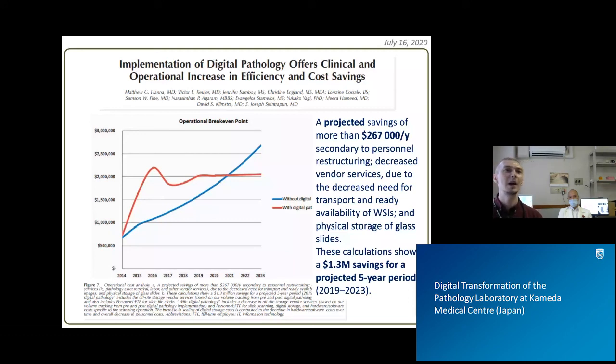And how much? Well, actually, I cannot answer in a simple way, yen-wise or dollar-wise. It depends, but for us, it's roughly $1 million for covering the 3 institutes. And you need to think about the storage, which is different: how much storage you need for cases, how much volume you have, and that would really decide the price.